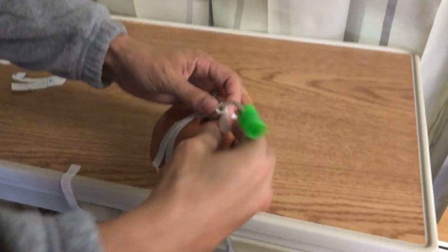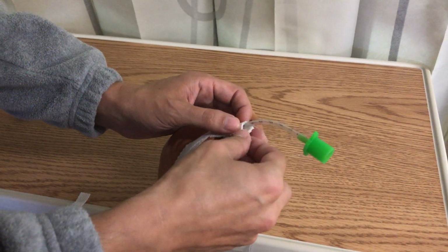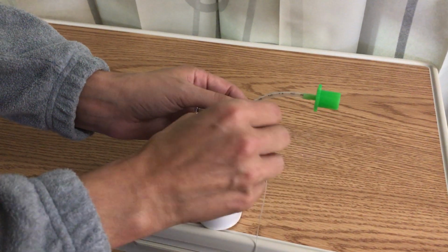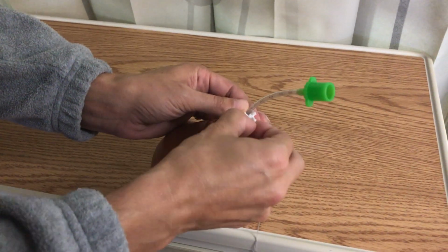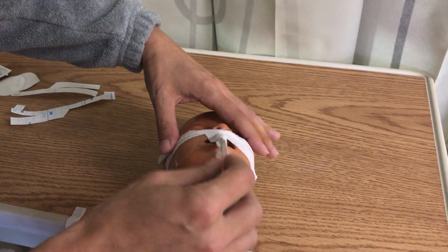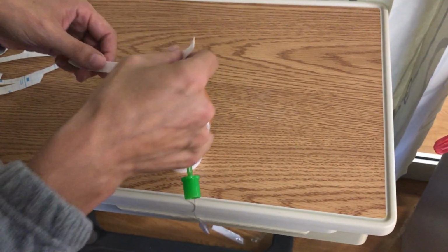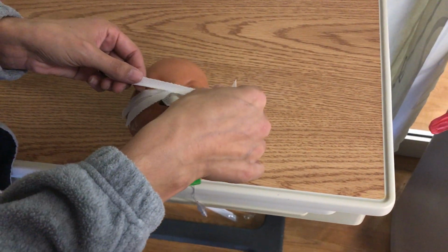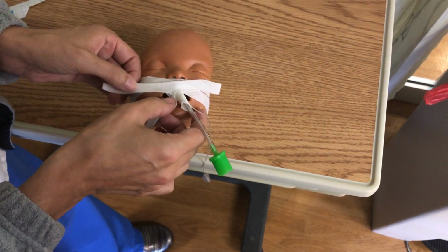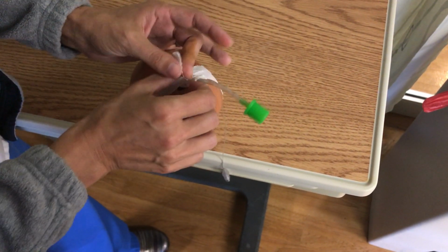So I'm going to wrap this around, and remember, this is a big courtesy tab right here, so that's not actually sticking to my tube. And I'm going to do the same thing with this one just to illustrate why this is bad. So I'll put another big courtesy tab there. Alright, and then for my third and final piece, I put this one on here and go this way and go around with this one.